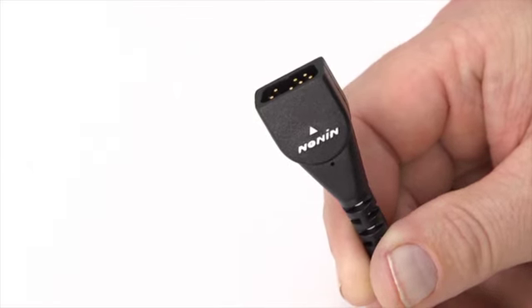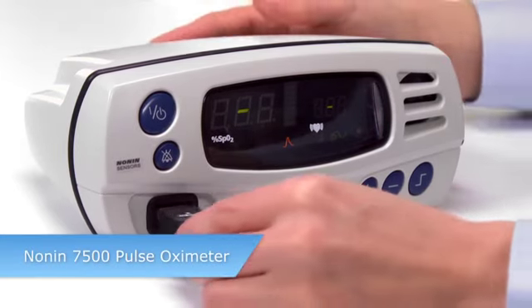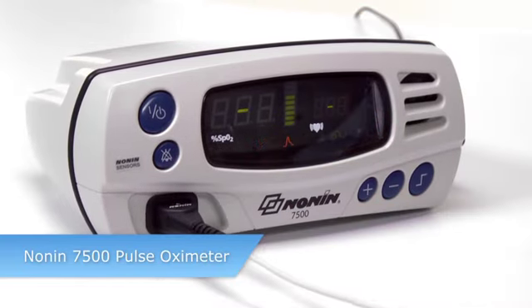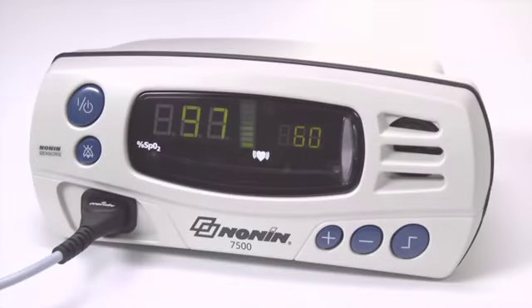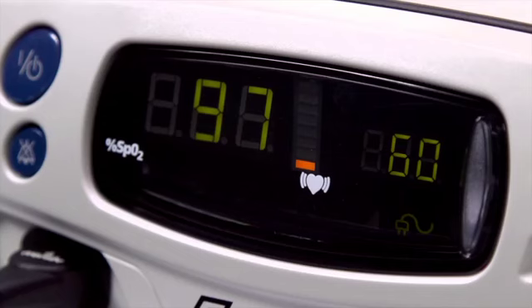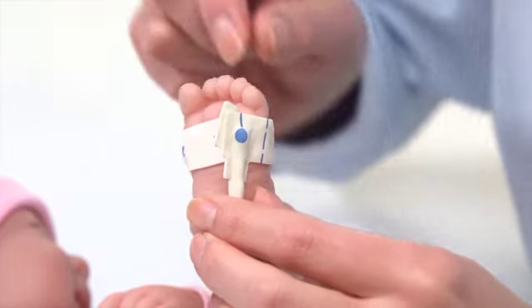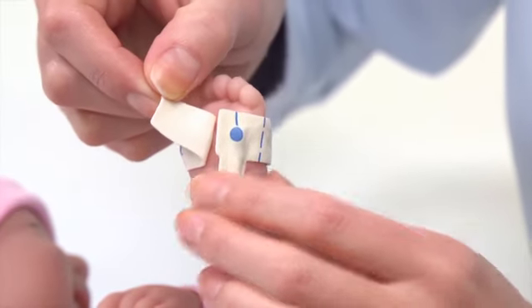You're ready to plug the sensor into the Nonin pulse oximeter to measure oxygen saturation and pulse rate. Nonin pulse oximeters have a pulse signal quality display that measures the sensor signal. If the signal is low, the emitter and detector may not be in proper alignment. Reposition the sensor to see if a stronger signal can be obtained.